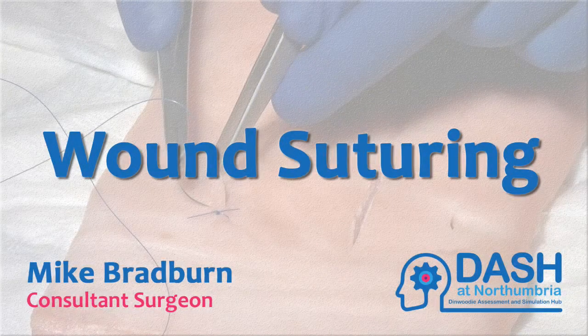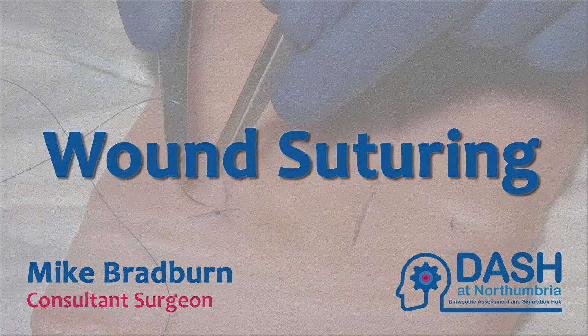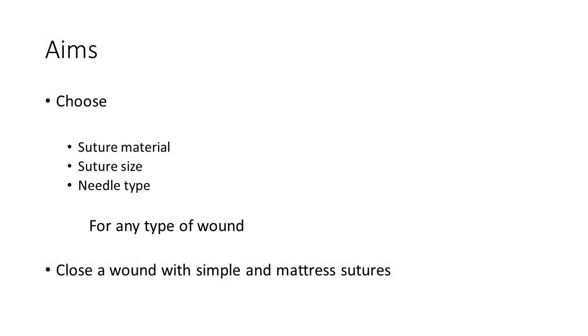Welcome to this brief video which will give you the basics of wound suturing aimed for the accident and emergency setting. At the end of this video you should be able to choose an appropriate suture material, choose the appropriate size of suture, and choose a type of needle to close the wound for any type of wound that you may come across. You should also, with appropriate practice, be able to close a wound with simple or mattress sutures.